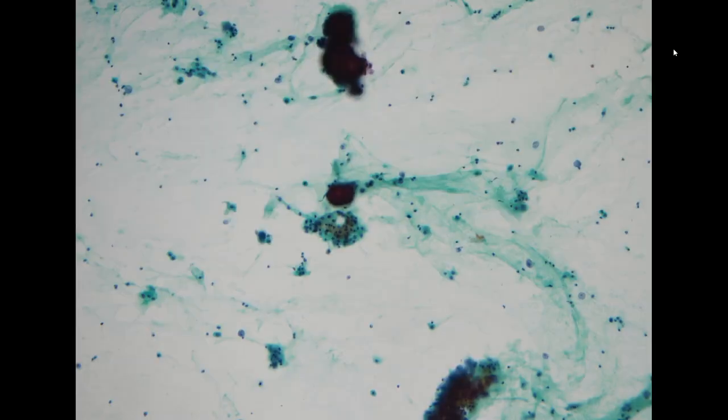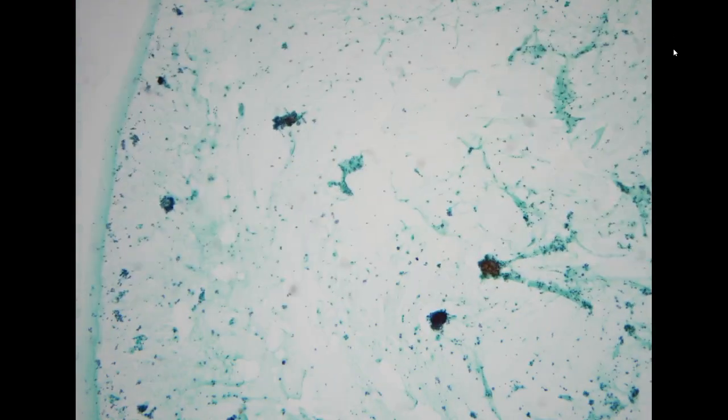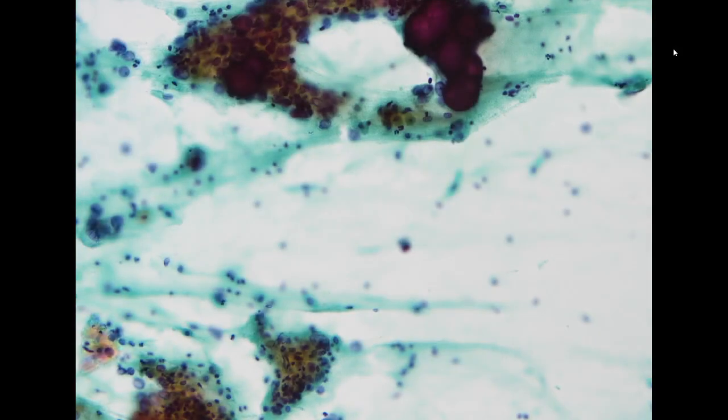It is more commonly seen in serous carcinoma, particularly coming from the ovary. So this is a psammoma body. When you see very high-grade tumor cells without any mucin, and this psammoma body, you will think, okay, this is not a usual cervical cancer. This can be coming from other places.